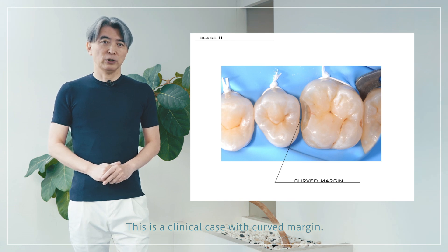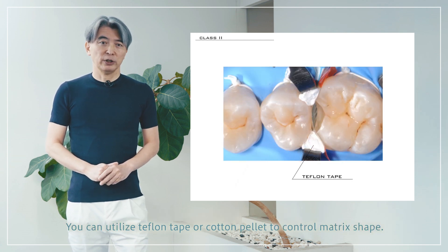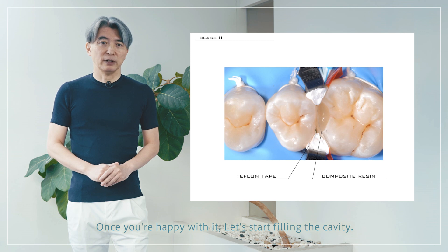This is a clinical case with a curved margin. After placement of the sectional matrix ring, some arrangement is necessary. You can utilize Teflon tape or a cotton pellet to control the matrix shape. Once you're happy with it, let's start filling the cavity.